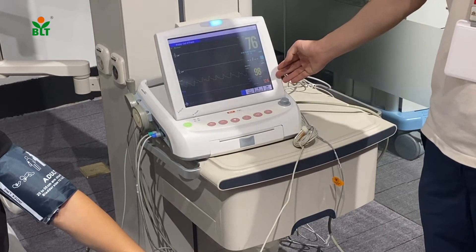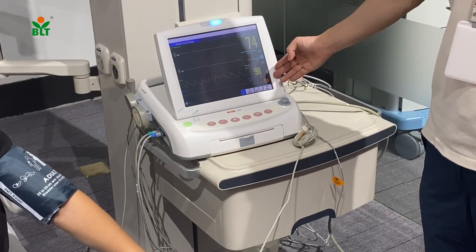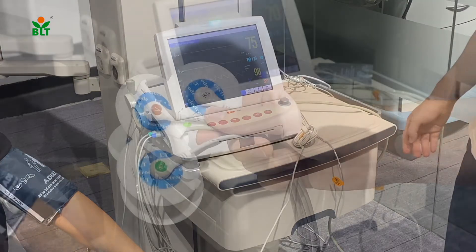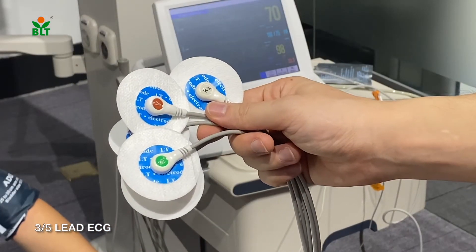This is the SPO2 probe. The SpO2 level is 98%. Blood pressure is 118 over 75.